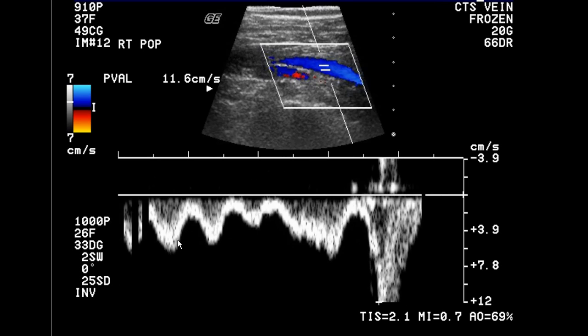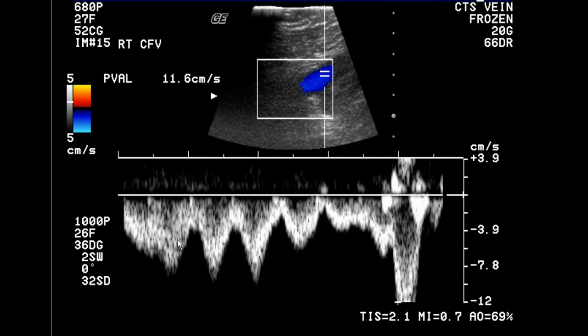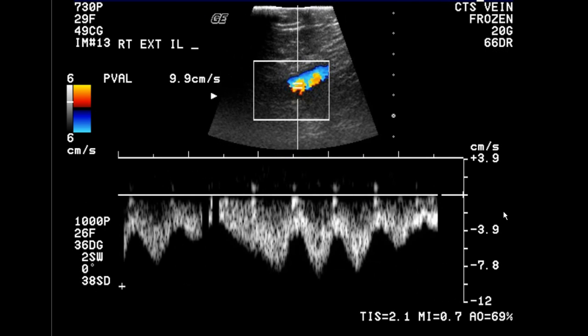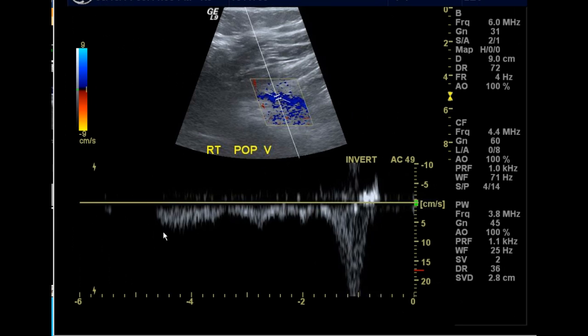There should be some variation in the normal waveforms of vessels. Here's an example of normal respiratory variation of flow through the vein. During inspiration, flow decreases because of the increase in intra-abdominal pressure. During expiration, venous return and blood flow increase — this accounts for that phasic respiratory variation. You're going to see this variation most commonly in the common femoral and proximal femoral veins, less so in the popliteal vein and distal veins.